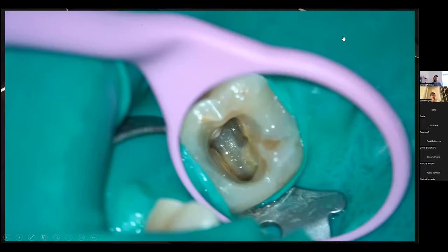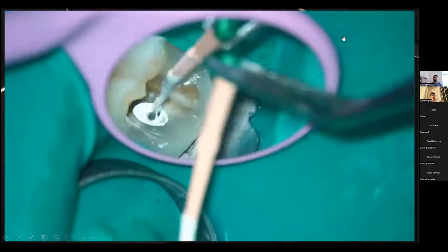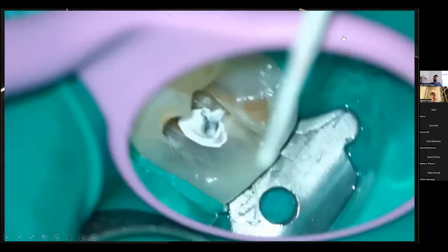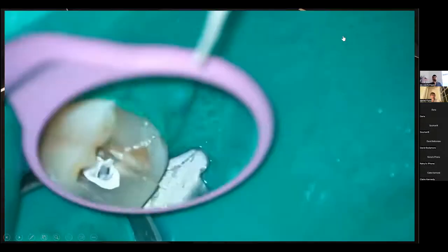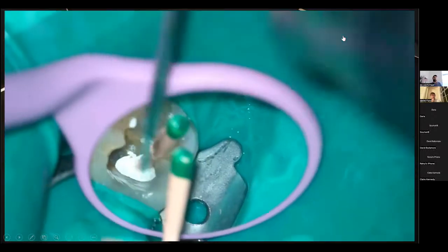So again, this was a very carious tooth, so we had a very wide open access here. So I did choose to do this just with a sealer coated on the GP cone. You'll see over here, I just place it to length, and I go in and check that it's actually coated the walls. To spread that sealer down the canals, I'll pump the GP into the canal a few times. Again, check that it's coating the walls well, and just place that to length.